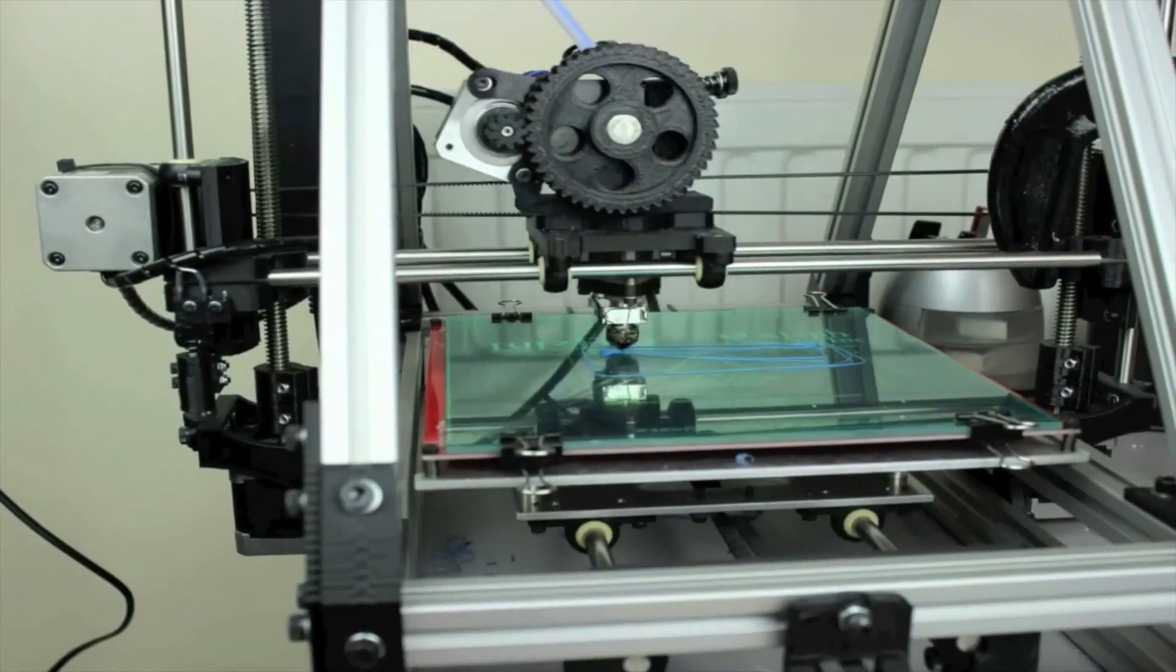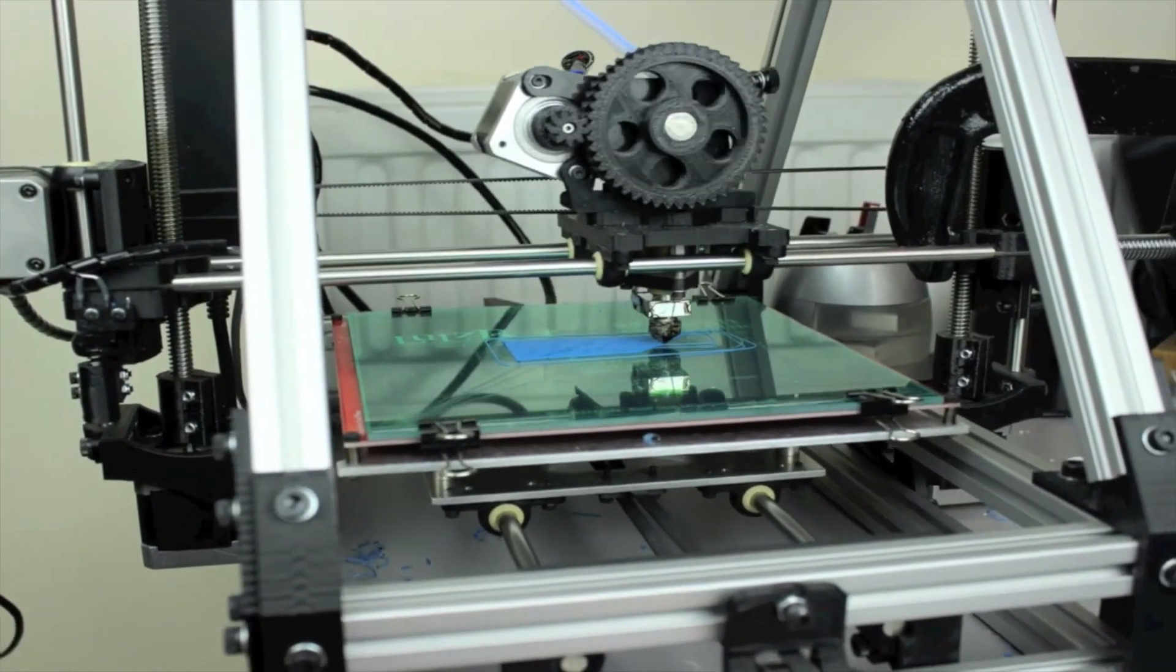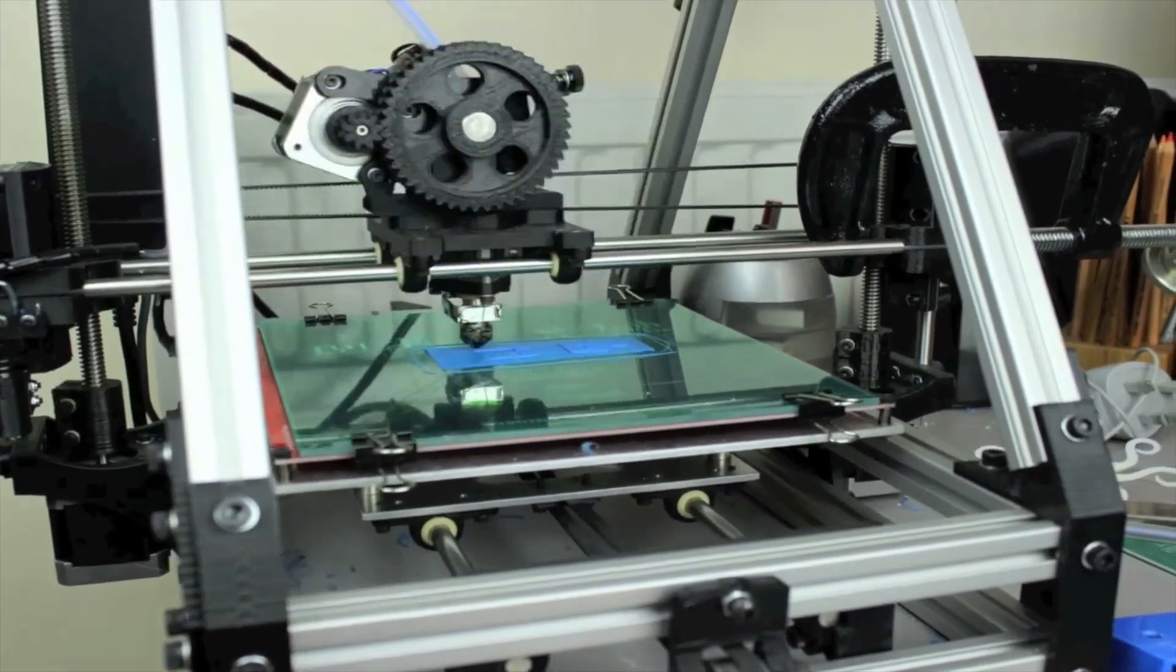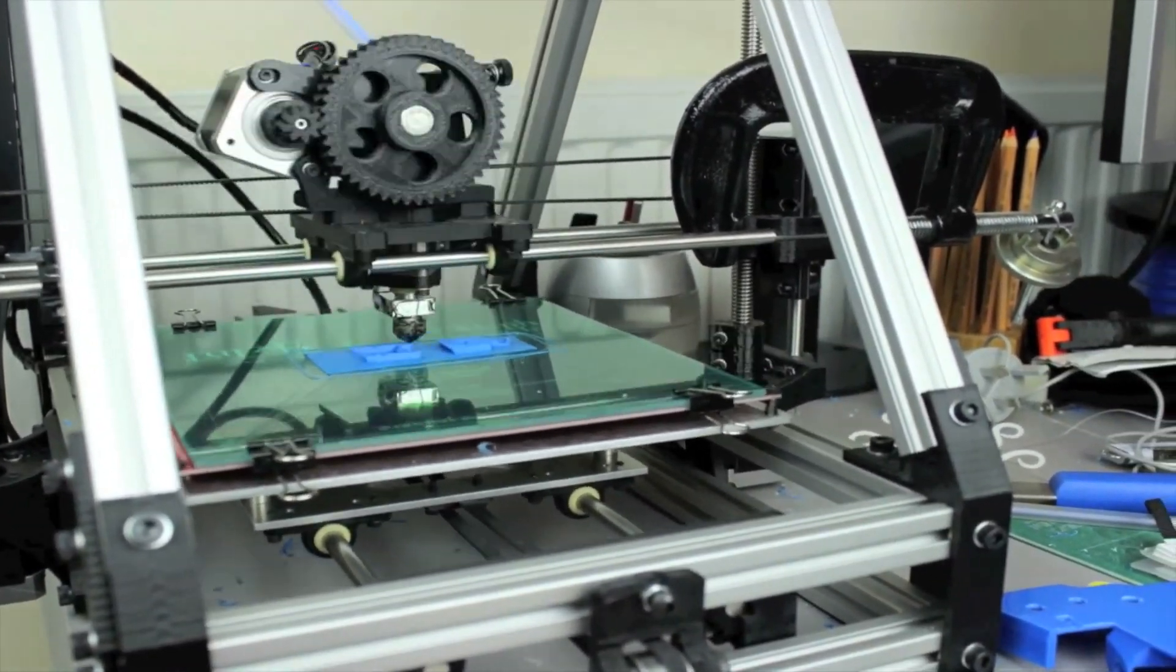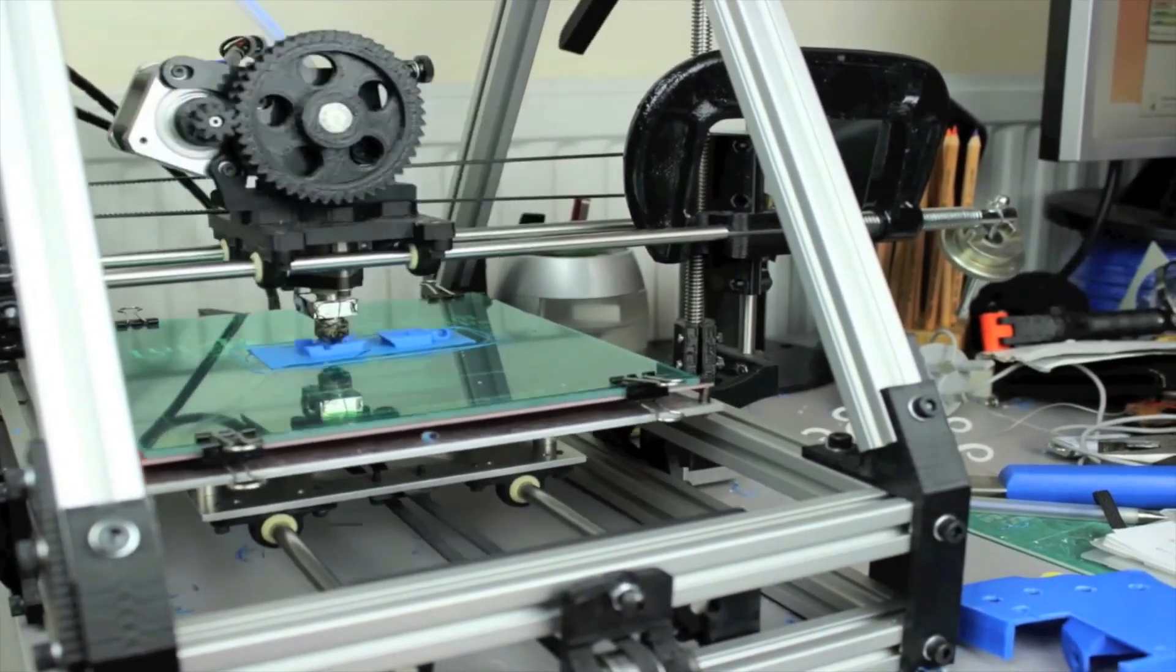The hand is 3D printed, so we print the parts off in plastic, and that's one of the things that makes it so cheap to make. We can use plastic instead of expensive materials like titanium or carbon fiber, and we can still get the strength that we need to make it robust enough for an amputee to use day-to-day.